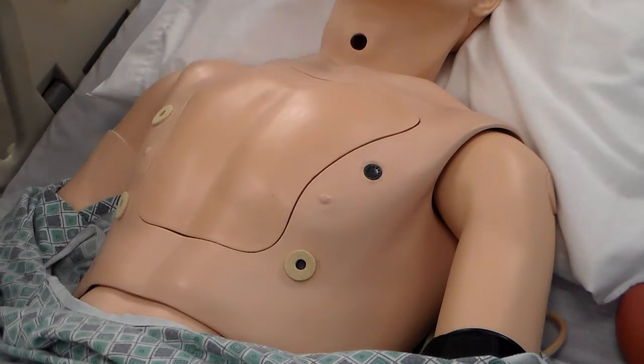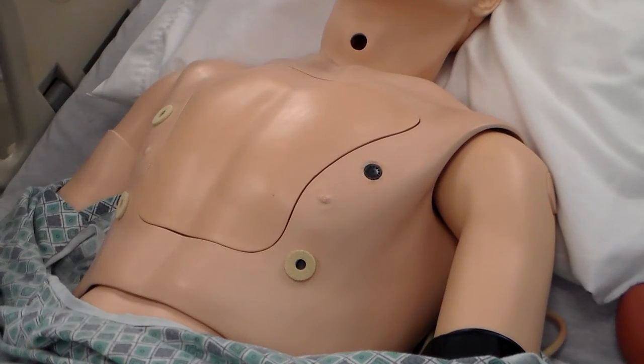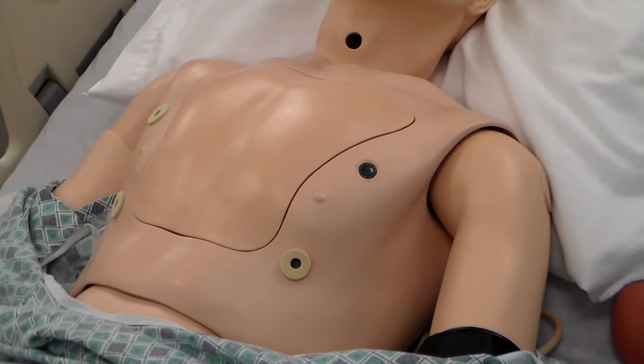Just make sure that you listen this way going down the chest. Doesn't matter right or left, whichever side you want to start on. All right? I'm going to pause it. I'm going to show you how to auscultate or listen to the back.